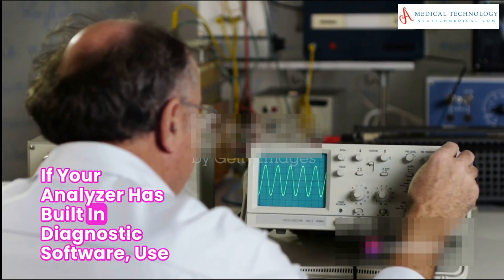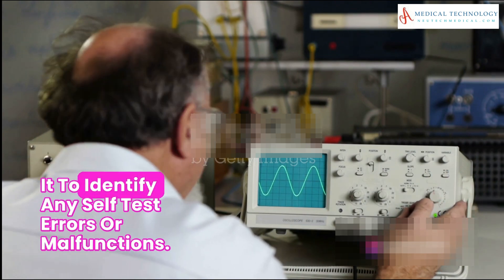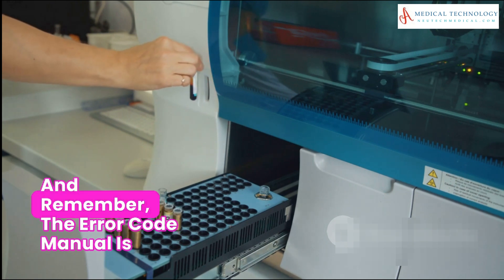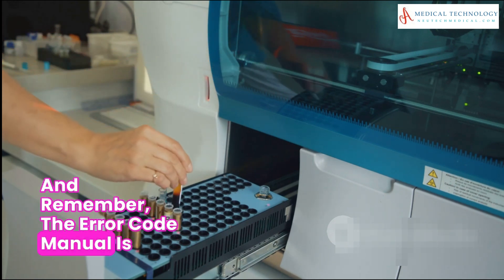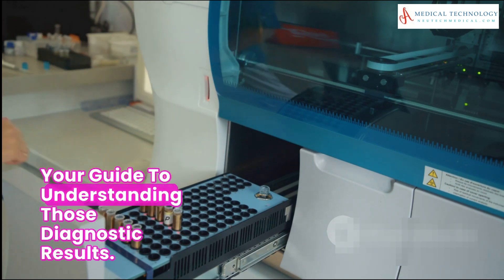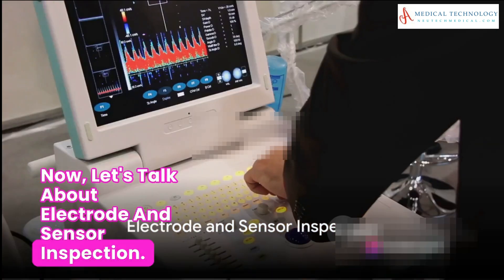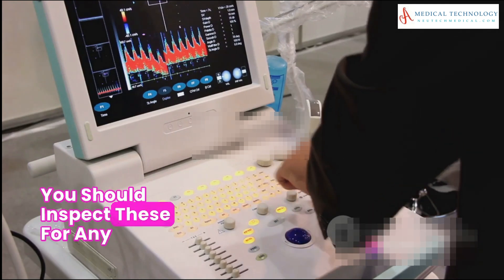Next, diagnostic software is your best friend. If your analyzer has built-in diagnostic software, use it to identify any self-test errors or malfunctions. Remember, the error code manual is your guide to understanding those diagnostic results.